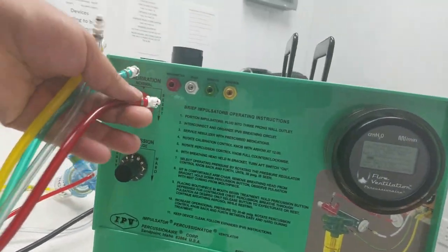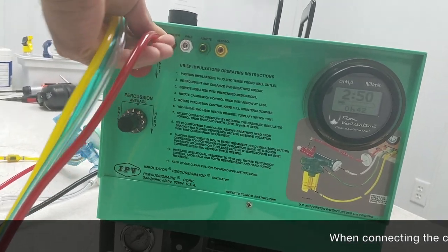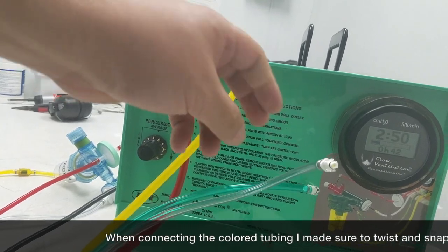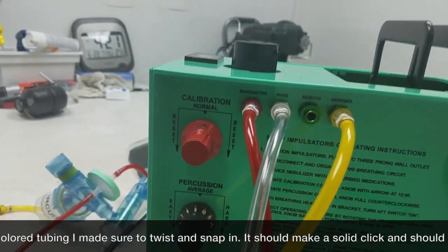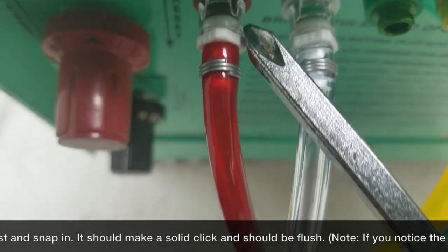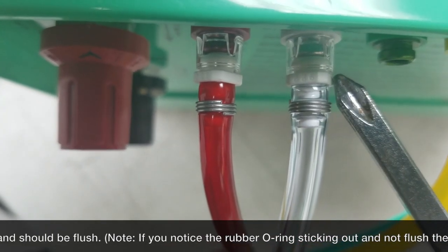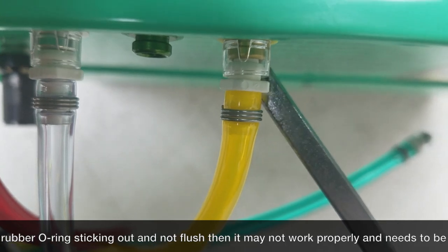Welcome everyone to our presentation. We're going to be showing the home IPV called the Impulsator Percussionator. We are connecting the Phasitron with the hosing: red, clear white, and yellow. Once those are snapped in and flush, we're going to secure that. The green cord we're going to leave disconnected — it's labeled remote.